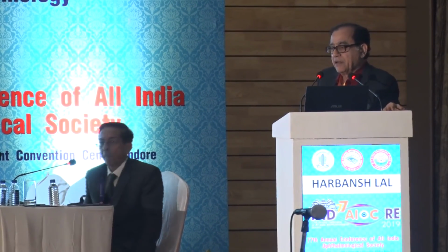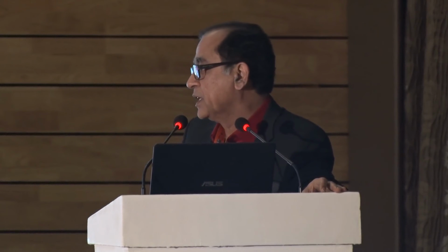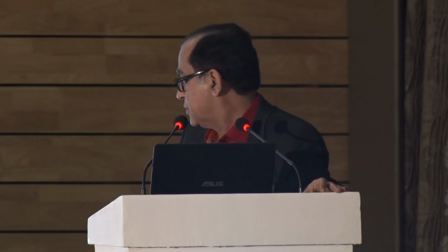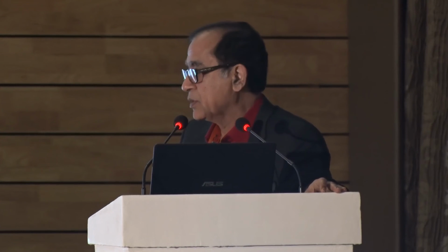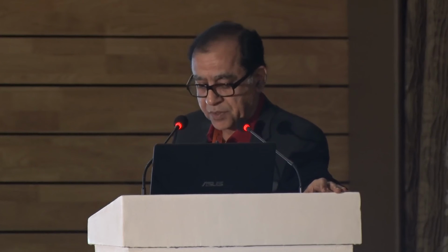I think either the eye becomes too hard or too soft. Most of the time it becomes too soft because you suddenly withdraw and something leaks over there. But if your needle is fine, 26 gauge, many times the eye will become too hard and the red glow disappears because of the hemorrhage, whatever the clear red glow. So if the blood is there, then you can see when you are looking at the operating microscope, some shaking things over there.